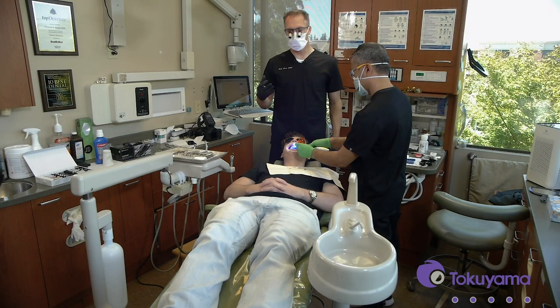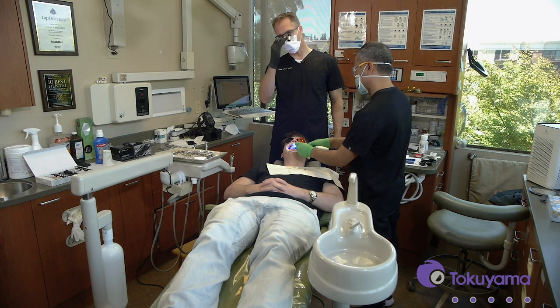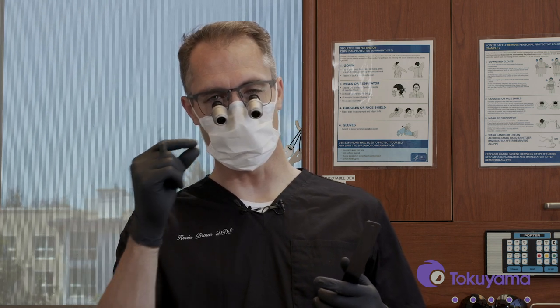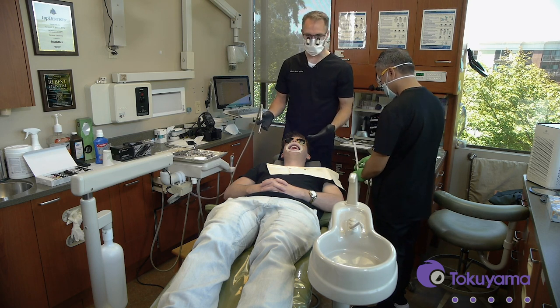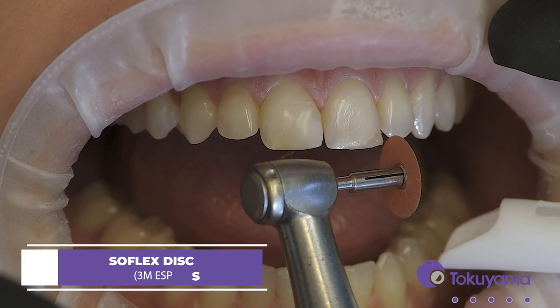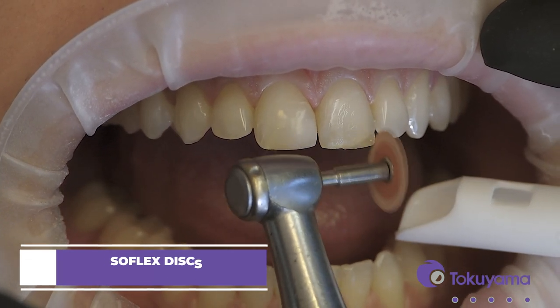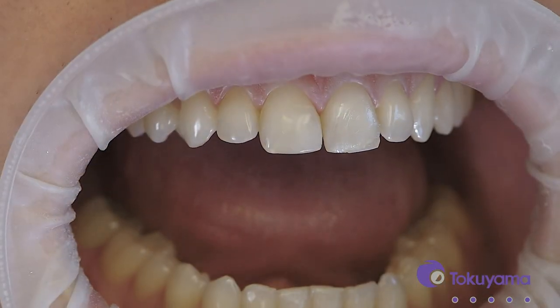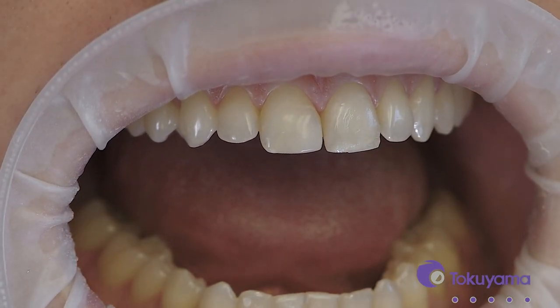One of the hardest things to do on an anterior restoration with a class 4 fracture is you've got this angled part of the tooth — it's a hard line. When you're trying to rebuild that back up with composite, it's hard to block that line on the tooth, and you can still see this little shadow on the incisal edge — a little translucent effect. That's where the blocker is really helpful in masking that. Once you've established this shelf with the blocker, I like to take a little disc and clean up the edges to get a better shape to work with so I know where all the next layers are going to go.